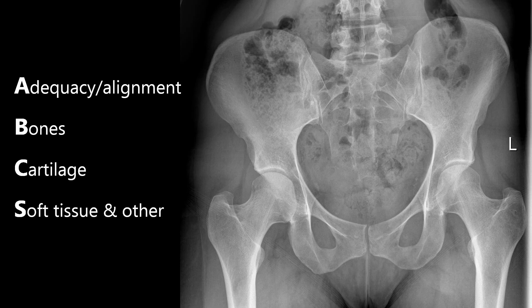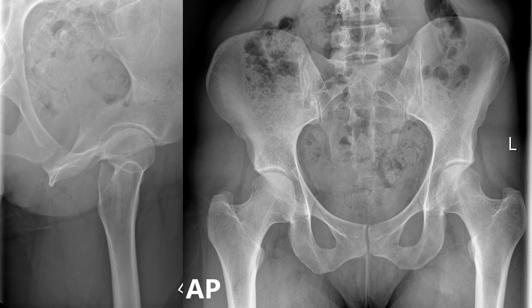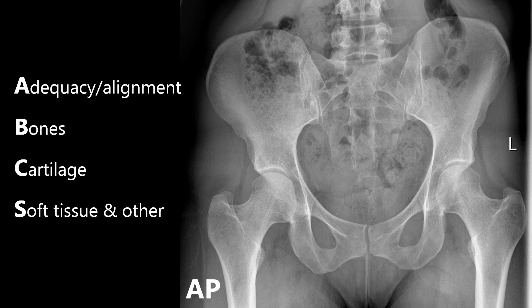Before you start to interpret any medical image, it's essential to check the patient demographics, image time and date to make sure that you have the right image for the right patient. Hip x-rays are usually taken in anterior posterior projection, or AP, which means the patient is facing the x-ray source. However, to avoid missing fractures, it's also good practice to have a lateral hip x-ray to interpret alongside it. This video will focus on AP projected hip x-rays, as these are the ones you'll come across most commonly in medical school exams.